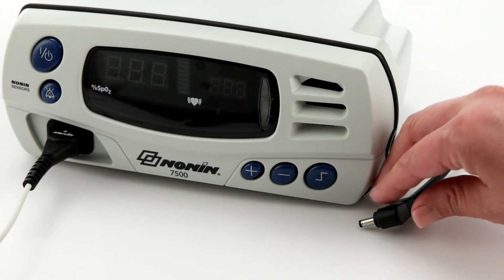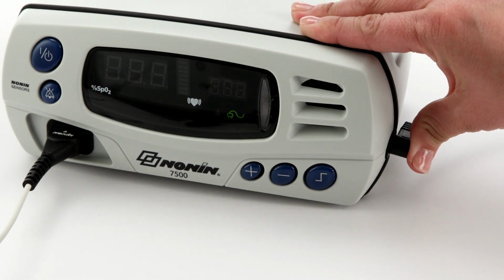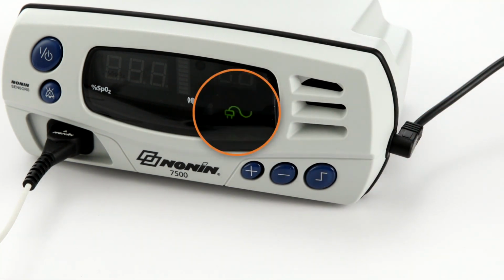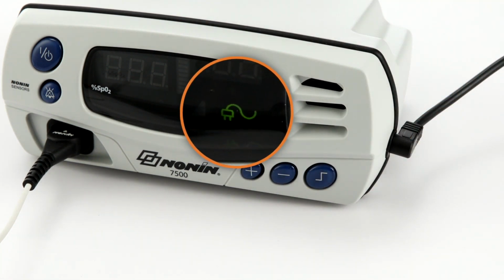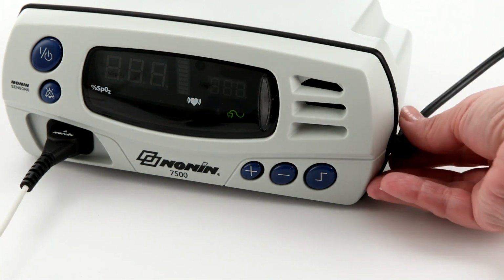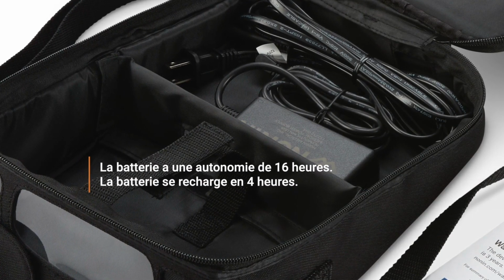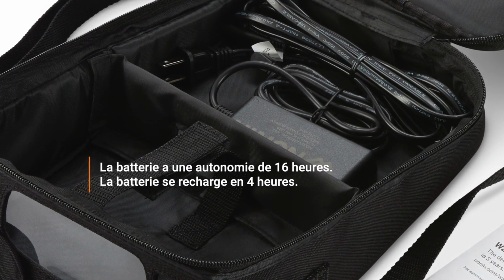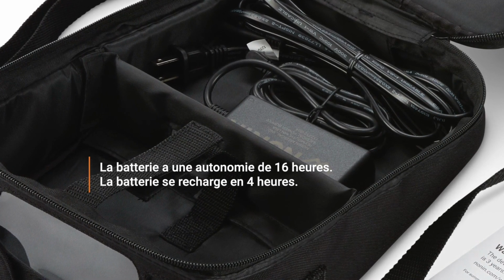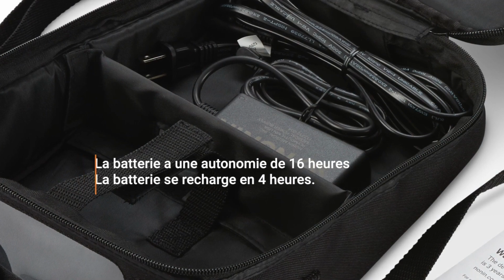The Nonin 7500 can be powered by 100 to 240 volt AC wall power. You will see a plug icon in the display when the oximeter is using external power. The oximeter can also function for at least 16 hours on a fully charged battery pack. The battery recharges when plugged in, whether running or in standby mode. Recharging takes about 4 hours when the battery pack has been depleted.